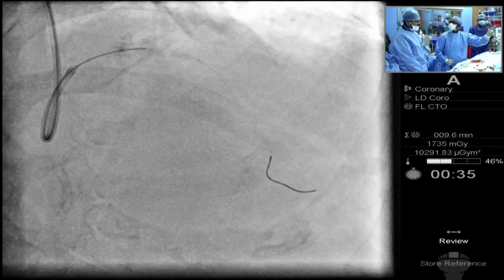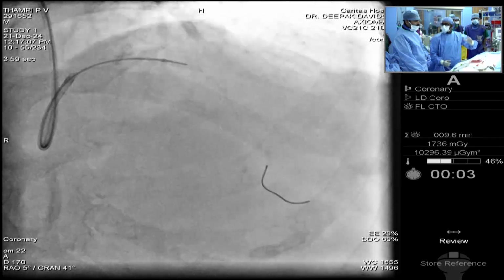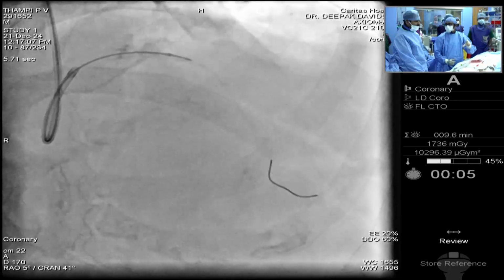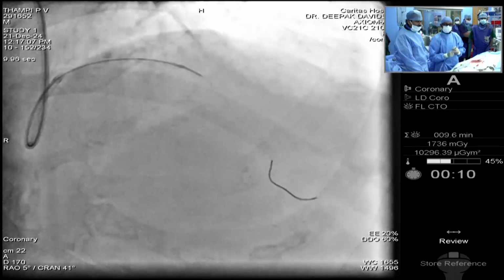Here you're sure the proximal half, as we're coming back, was not touching anywhere at all. That pitch was totally different compared to the distal half of the lesion. I think we'll stop now. There is some ST elevation. I think we'll stop.